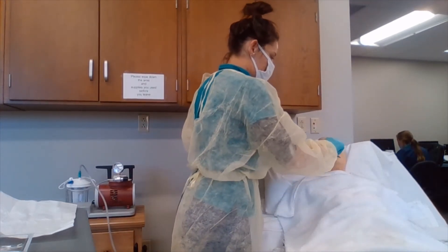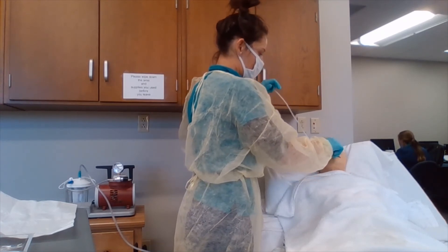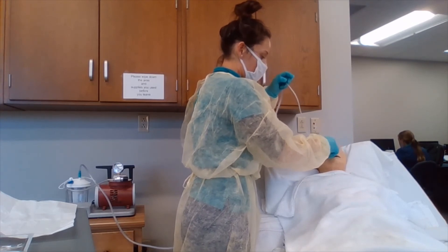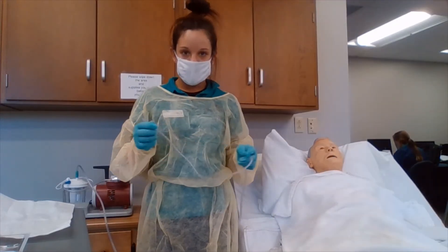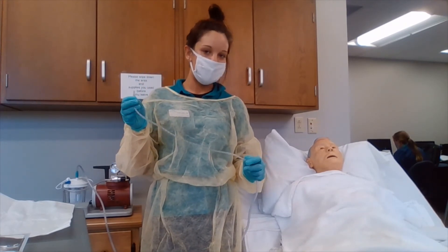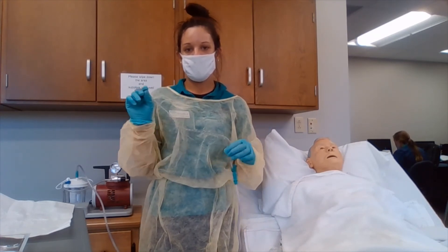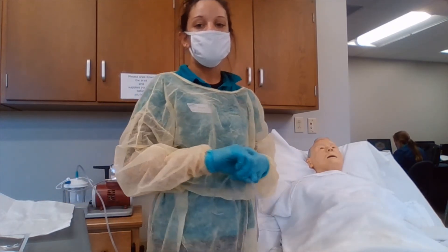During the procedure, we are going to occlude the suctioning port with our non-dominant hand. As we withdraw the catheter, we're going to do it in continuous rotation movements. We are going to limit suctioning time — each pass is going to be between 10 to 15 seconds, and we are not going to suction for more than five minutes total. Between intervals, we are going to flush the tubing with normal saline solution for lubrication.